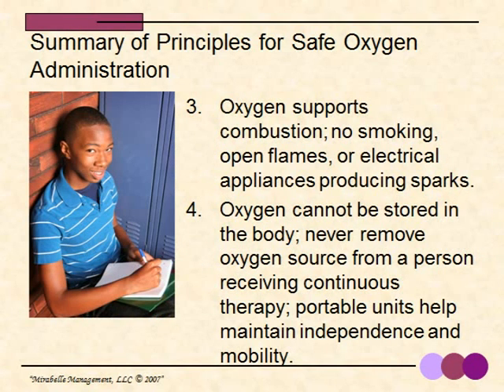Number 3, oxygen supports combustion, so no smoking, open flames, electrical appliances which could produce sparks. Number 4, oxygen cannot be stored in the body, so you never remove an oxygen source from a person receiving continuous therapy. Portable units help maintain independence and mobility.